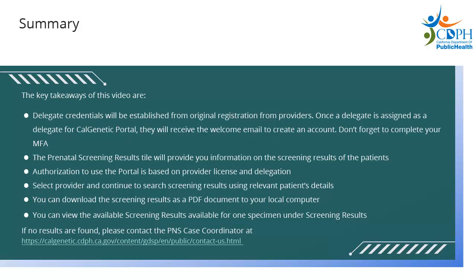You can download the screening results as a PDF document to your local computer. You can view the available screening results available for one specimen under Screening Results. If no results are found, please contact the PNS Program Case Coordinator at the link mentioned on the screen.